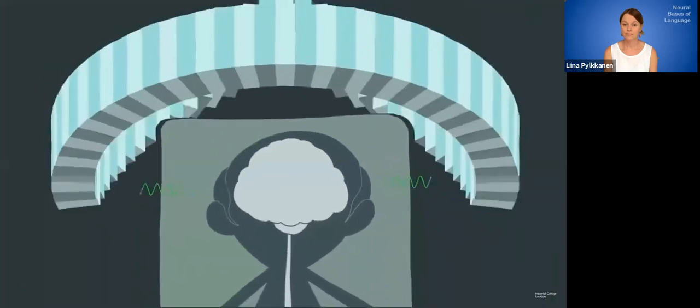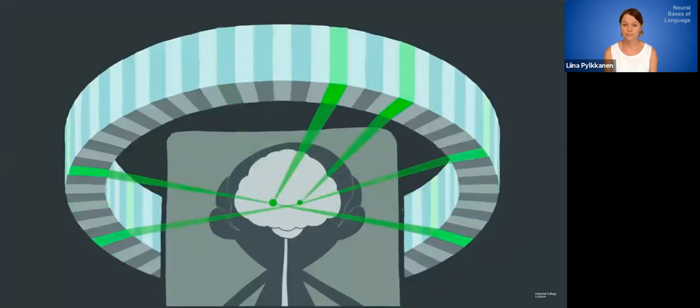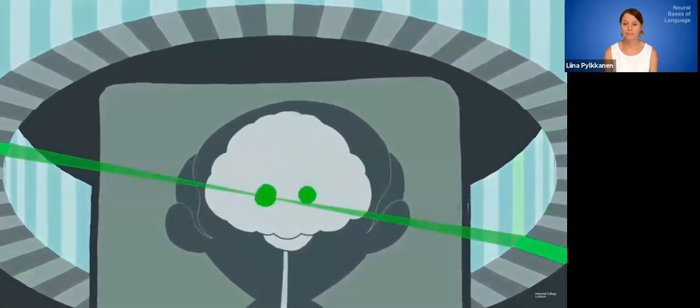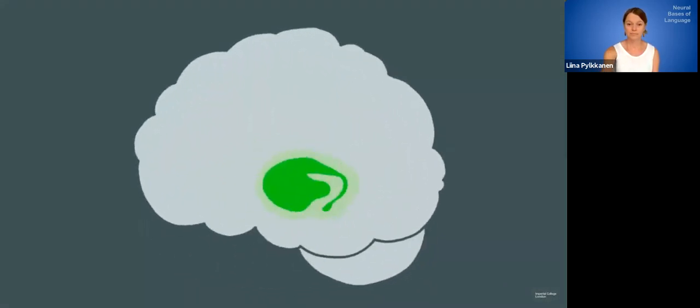The PET scanner is like a big ring of Geiger counters. When it detects 2 gamma rays on opposite sides of the ring, the doctors can calculate where in Dave's body the tracer must be. By detecting thousands of these events every second, and with some clever computer processing, Dave's brain activity is revealed in 3 dimensions. Something no other imaging technique can do.